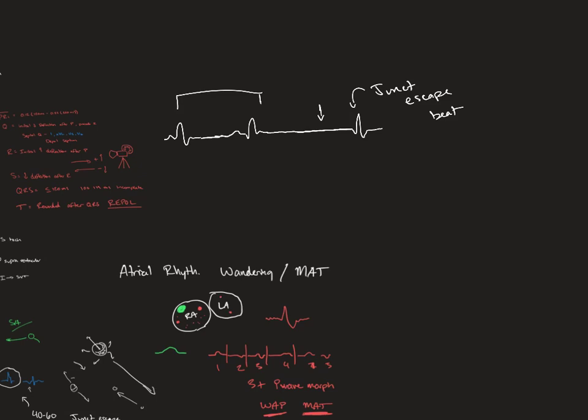In the same way, let's pretend this continues down here. You have this ugly ventricular thing, and it's really slow, this duration is super long. That would be a ventricular escape, because the heart has all these little backup plans. SA fails, AV fails, ventricles fail, agonal. Your Purkinje fibers are barely making things work.